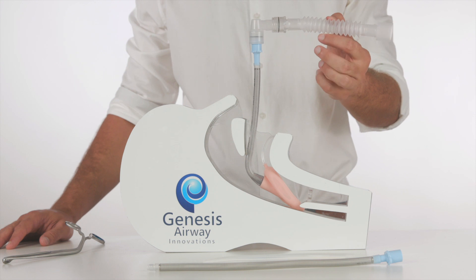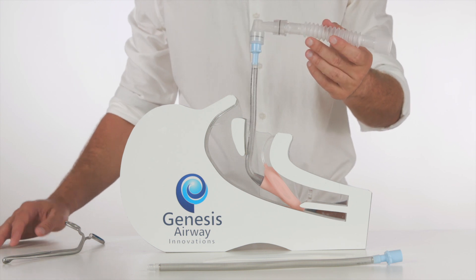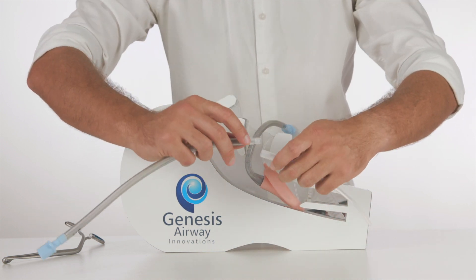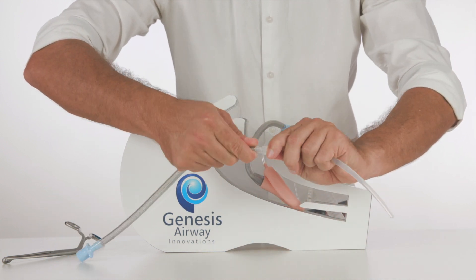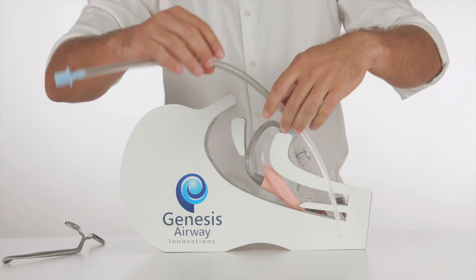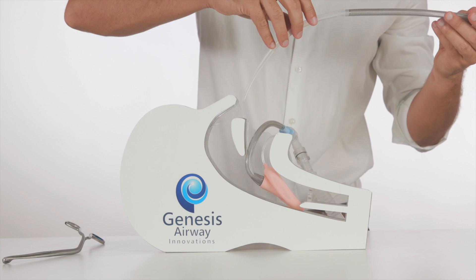We begin with the patient being ventilated with a laryngeal mask which is being placed orally. The flexible reinforced airway tubing is connected to the introducer with a twisting motion. Using the most patent nostril, the atraumatic introducer is advanced into the nasopharynx.